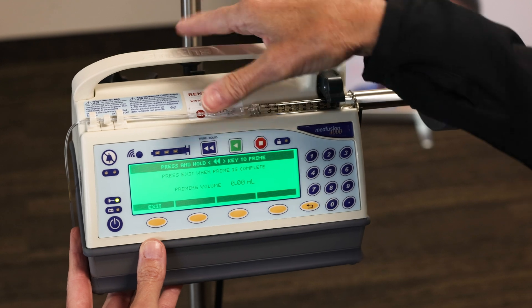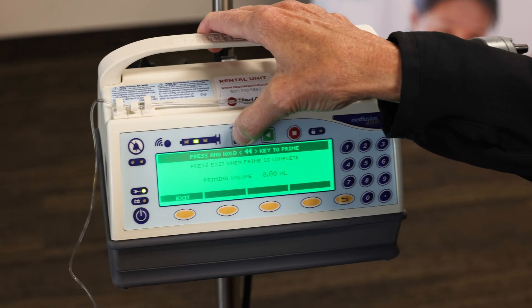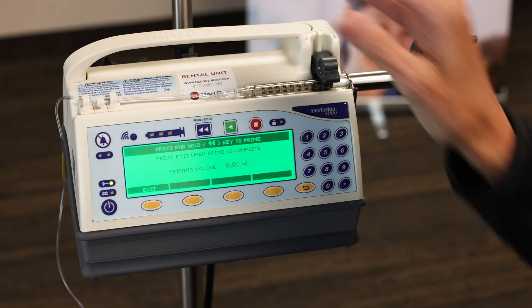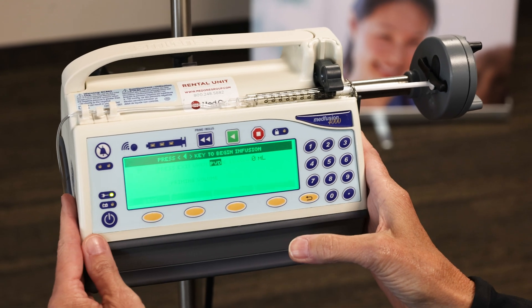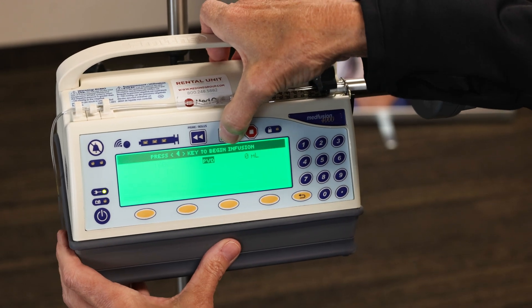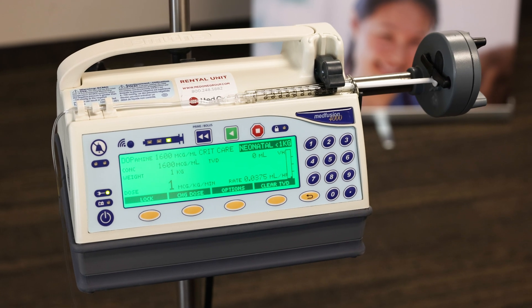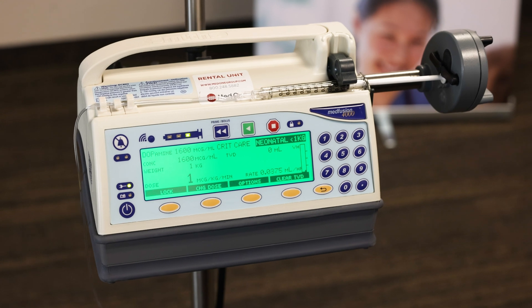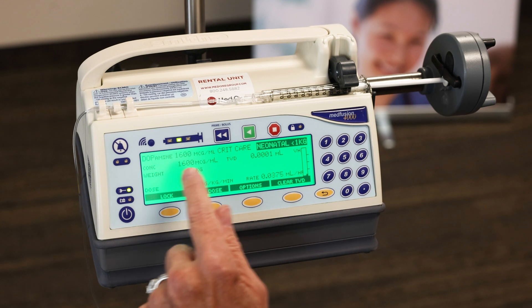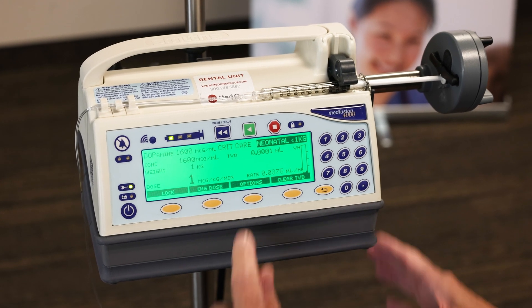Here's your prime feature again — press and hold the prime button until we see our fluid come to the end of the set, then let go once prime is complete. Press exit. Then go to the green start key and press it. You should see the syringe indicator light up right to left, indicating we're infusing. On screen you have the name of your drug, the neonatal profile, the concentration, total volume delivered, and your dose, which calculates a rate.